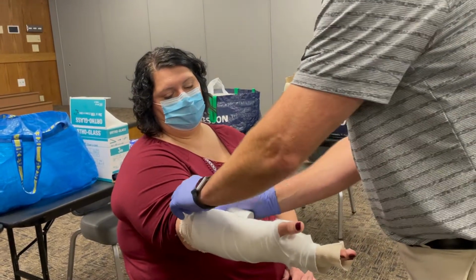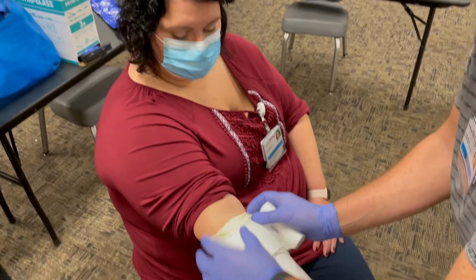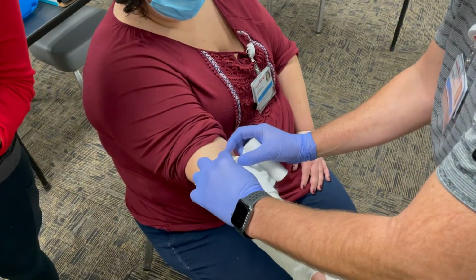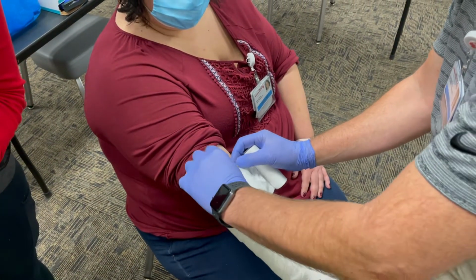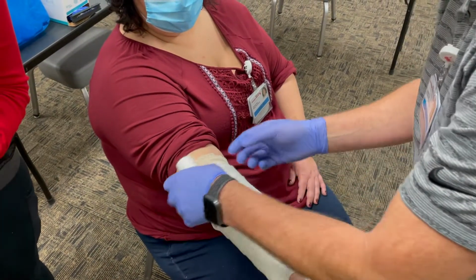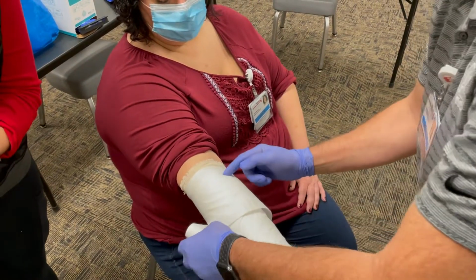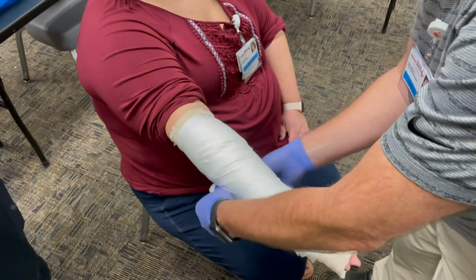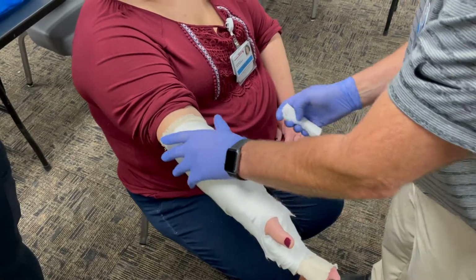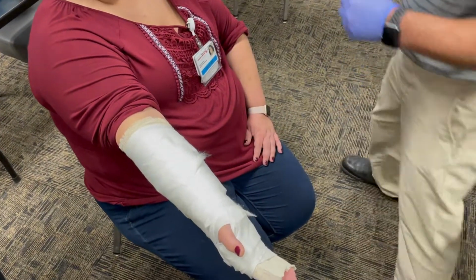And here's their antecubital fossa. See the wrinkle there? So that's their antecubital fossa. I want the splint to go up 2 inches from that. So I'm going to do my Webril up past that because I'm going to roll this down. And so your splint's only going to go to there. So you're not immobilizing the elbow most of the time for these types. You don't want this to pinch when they bend their arm up. You don't want it to pinch.